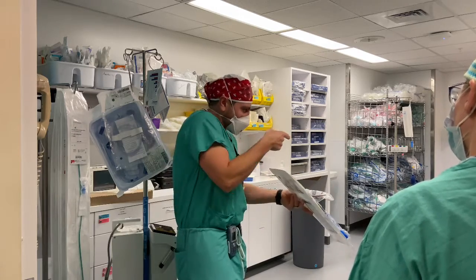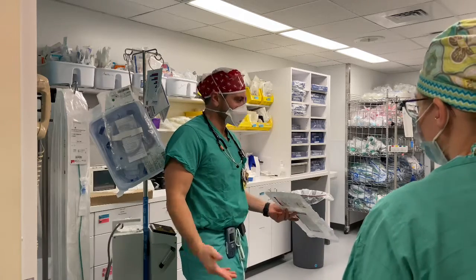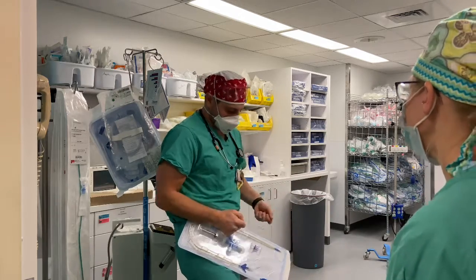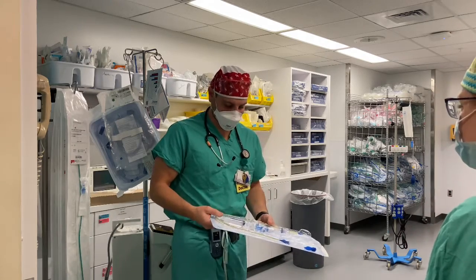When somebody's trying to thread the needle on a camera, you watch them struggle for 10 minutes and they never do it. Whereas if they just took it off and did it by hand, it takes 2 seconds. Okay, so that's a really common mistake that we see.